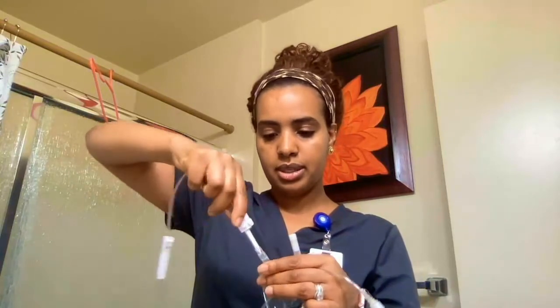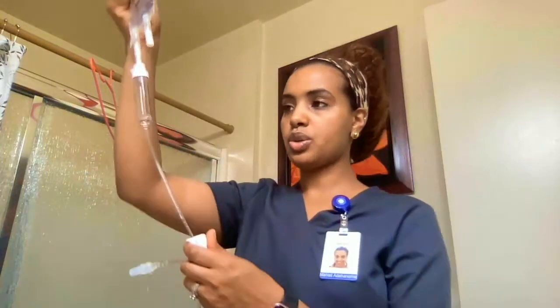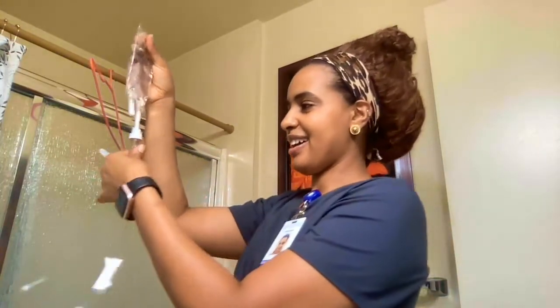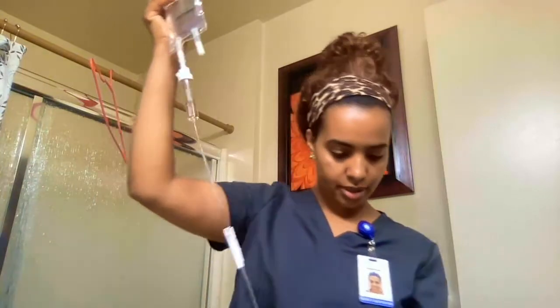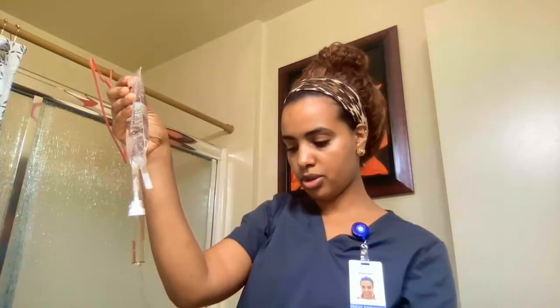I'm going to go ahead and spike my fluid bag, close the clamp for now, and fill the drip chamber halfway. Then I'm going to check that my tubing is primed correctly — making sure there is no air in the tubing. Always make sure there's no air in the tubing.